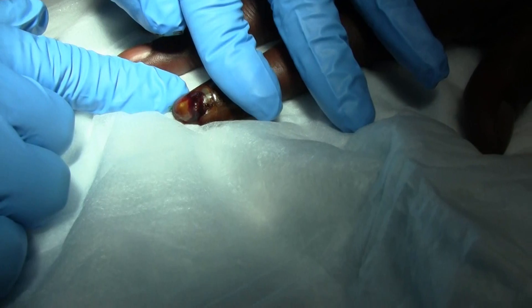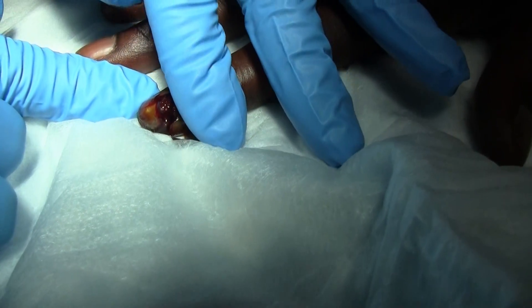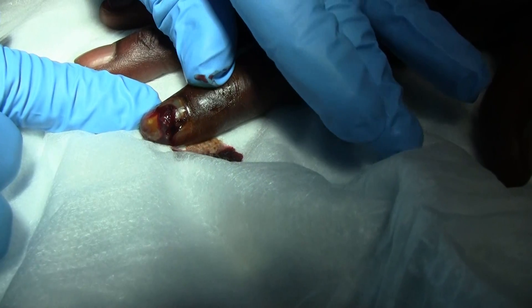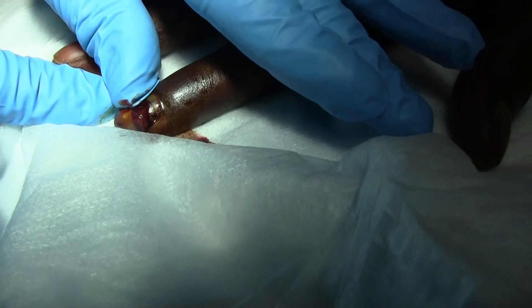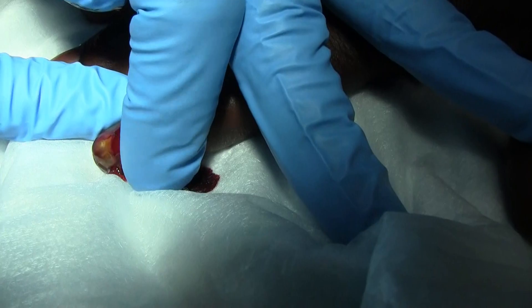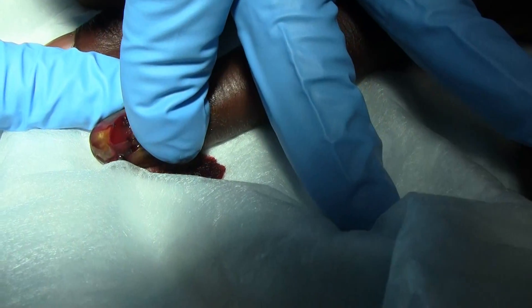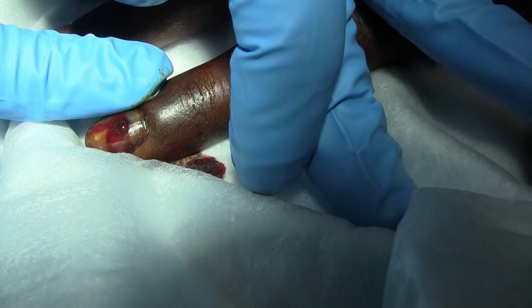Now we're just milking a little bit of the blood out of there, and some more blood is coming. That's working really well. You think about it, you've got a fracture in addition to that. So the pain is going to be relieved from the nail, but you still have the bone fracture, so it's going to be painful.